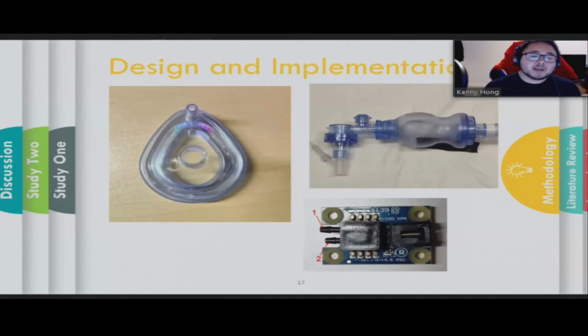The resuscitator itself consists of a plastic resuscitator that can be found at most hospitals, a teardrop face mask, which is plastic, and the sensor is a gas sensor that measures 0 to 100 kilopascals.